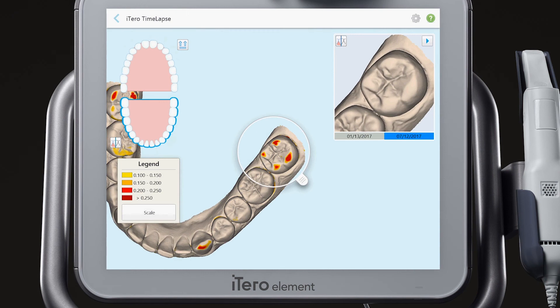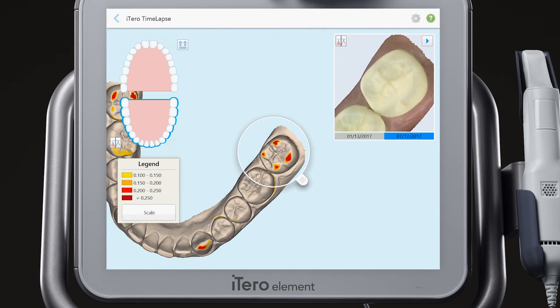Notice that you can even zoom the image in the animation window, as well as pause the animation and view in color.